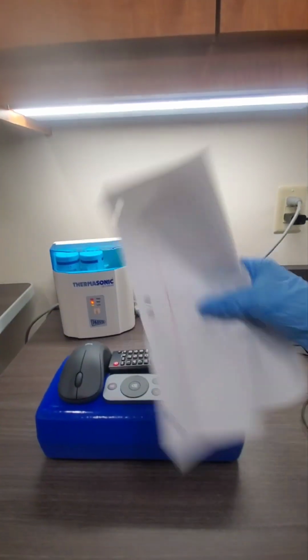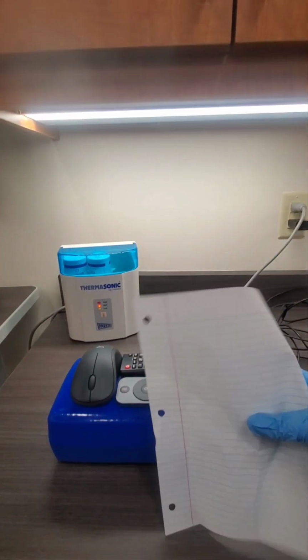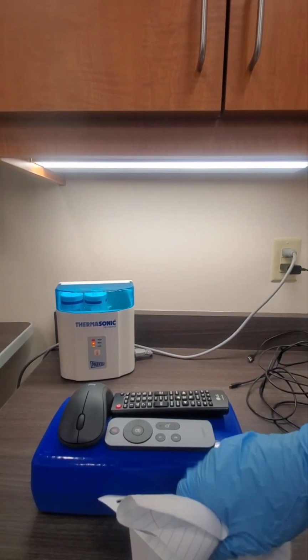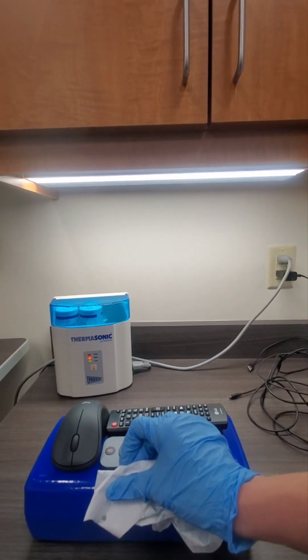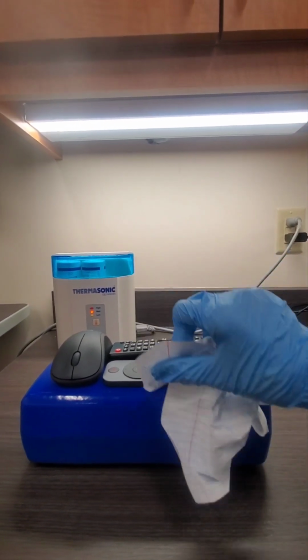Now if I want to resolve this remote from this blue block here, I have to have a short little pulse, right? A tiny short little pulse. I'm going to shrink this guy down, SPL divided by 2, little pulse to fit between these two things here in order to resolve them, okay?